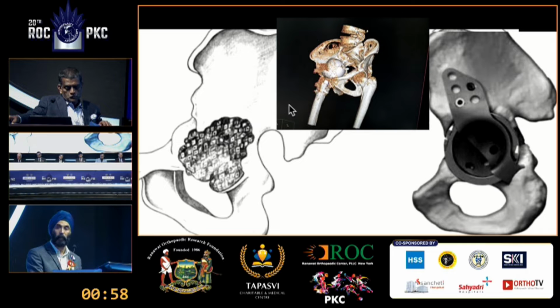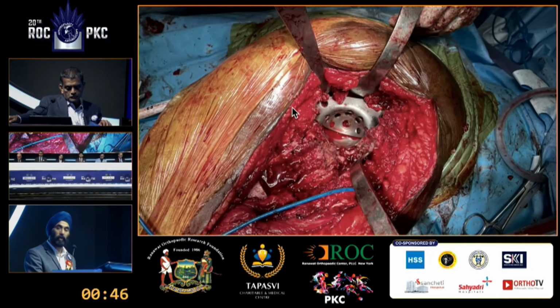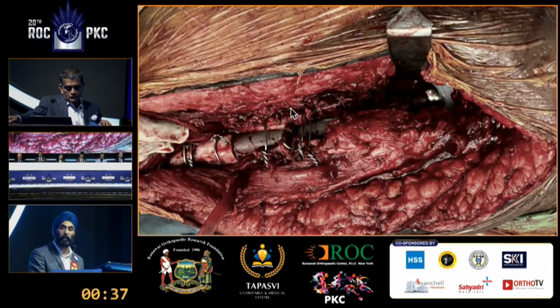Because there was an impending pelvic discontinuity and we think that this probably might be dangerous, we removed the cup and the screws and implanted a larger diameter cup on the medial side and treated it like a cup cage construct. Over that, a cage was put in, impacted, and then filled with screws and graft. Finally, we cemented a cup onto that and then used a long, fully porous coated stem, and put that osteotomy fragment back. We were not able to bring it absolutely down, but we were able to restore the abductor mechanism quite nicely.